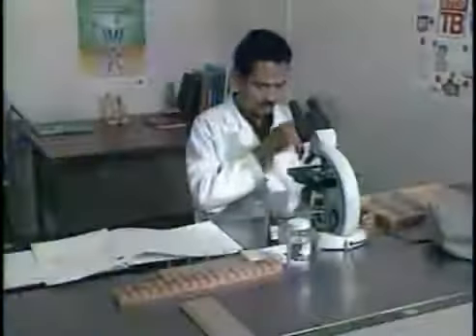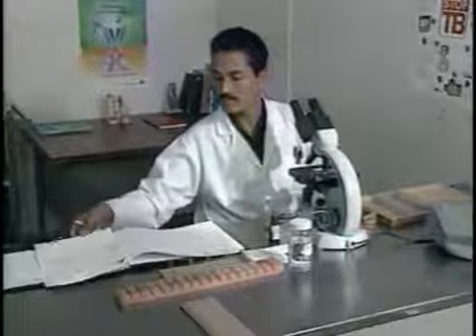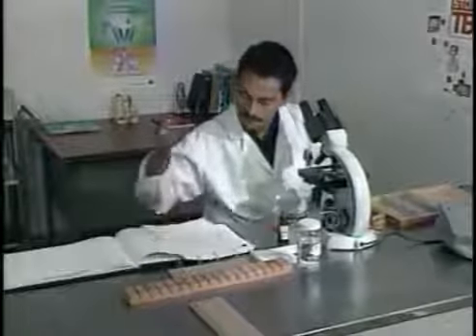Tubercle bacilli resemble fine red rods standing out against the blue background. They may be slightly curved, granular, and may occur singly, in pairs, or groups. Count the number of AFB per field and record this figure on the lab report.